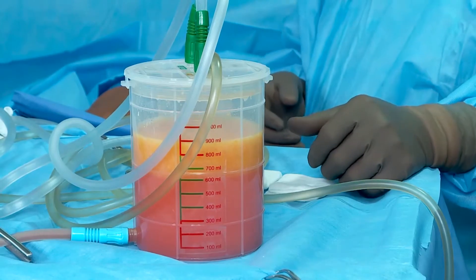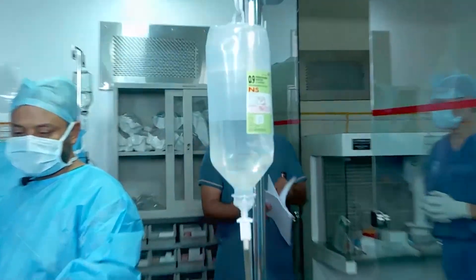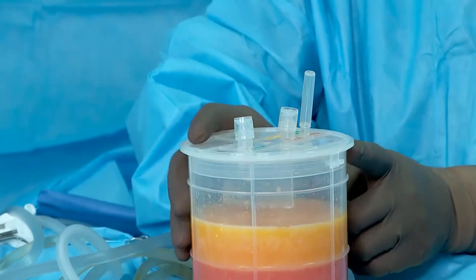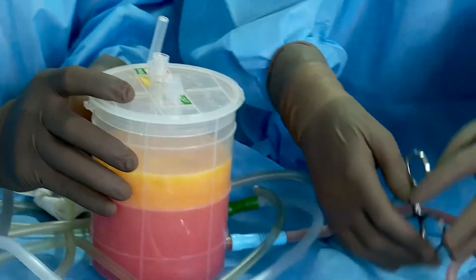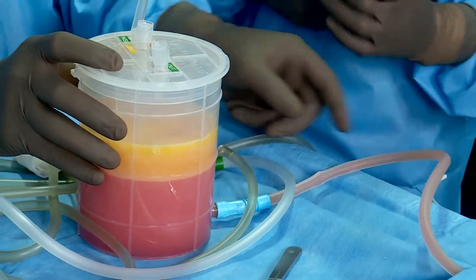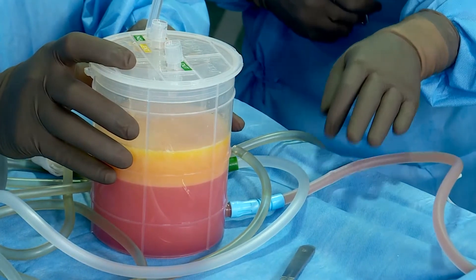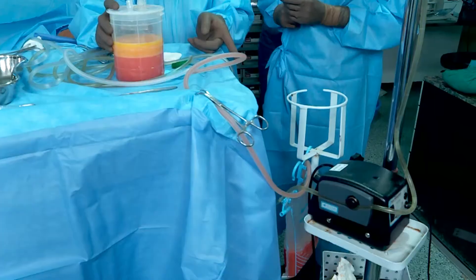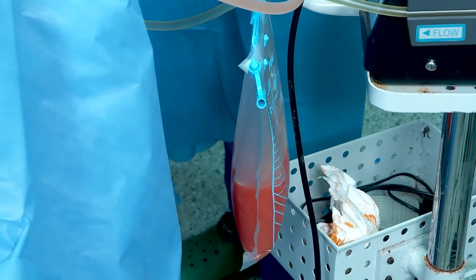We washed with normal saline along with soda bicarb — one liter of saline and one ampoule of soda bicarb. We have now removed the suction tubes, kept the box, and cut it. The excess fluid is discarded by gravity into a disposable bag connected at the outlet.